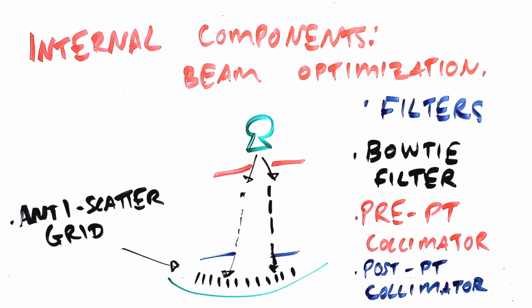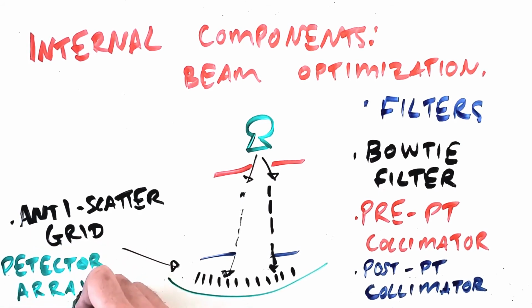Unlike in conventional X-ray, in some CT systems the grid lines are oriented in both horizontal and vertical directions, much like what nuclear medicine technologists might call a collimator. Different professions, different language. And the reason we can do this is because we know that the tube and detector will never be angled relative to one another in CT, where in X-ray we're used to angling in one direction relative to the detector, so we have grid lines only pointing in that direction.